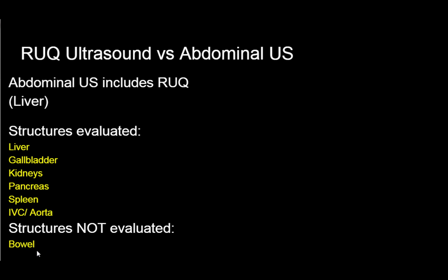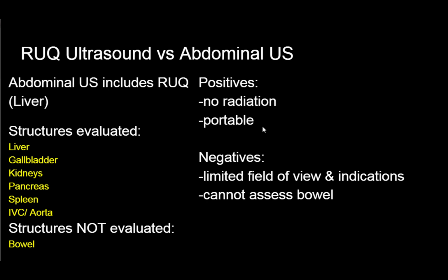Ultrasound is not good for evaluating bowel because of bowel gas, which interferes with the acoustic waves. There are certain advantages for ultrasound. Specifically, there's no radiation. It's portable and it's easy to do. However, there's limited field of view. So if there are pathologies involving the entire abdomen or pelvis, you would only have a very limited evaluation of that.